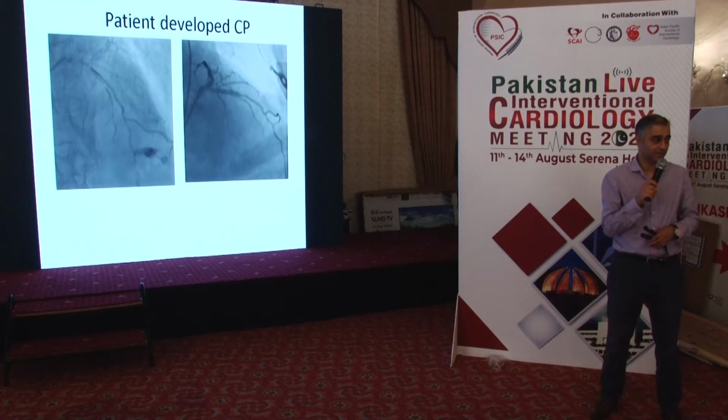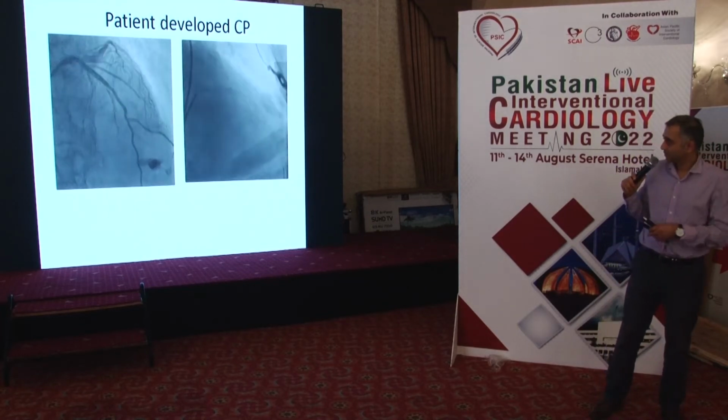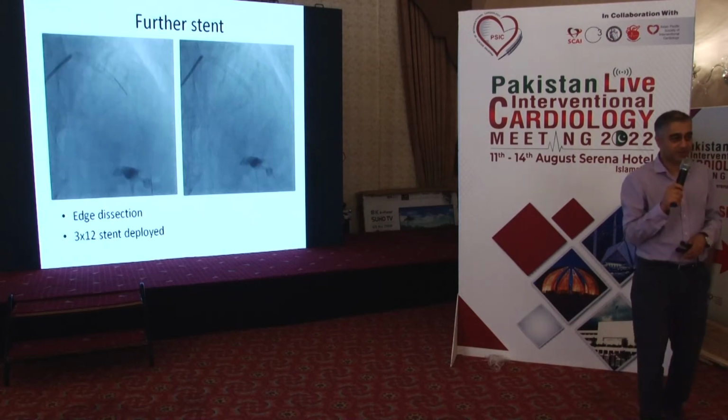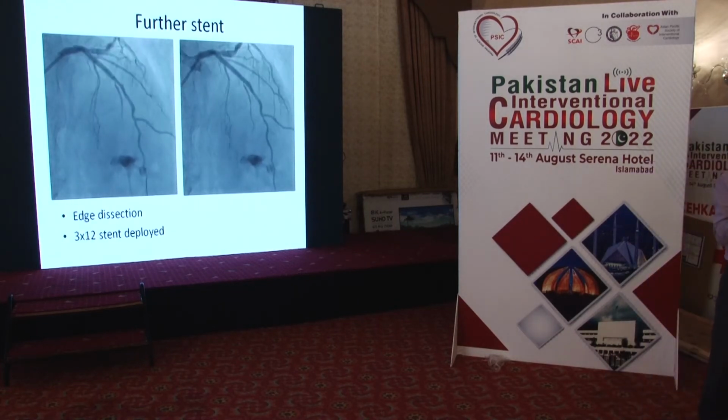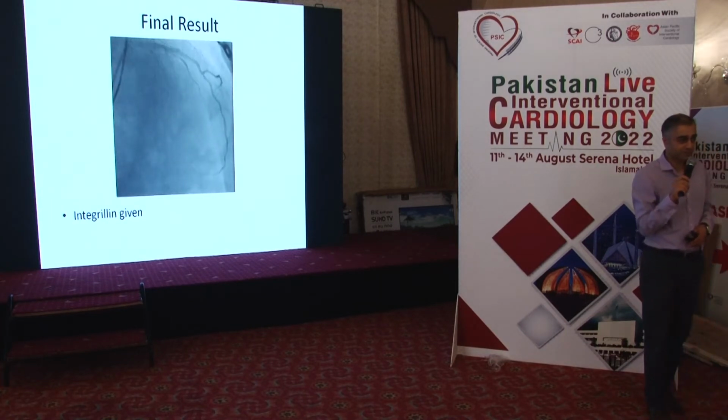So how are you going to treat that? Another stent, yeah. What size? 3 millimeter? Yep. Okay, next slide. So I took a 3 by 12. I thought, we'll just put an overlapping 3 by 12 stent in there. Next slide. That's the final result. Happy with that?